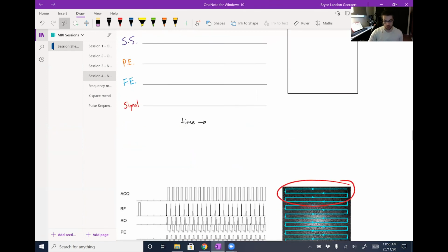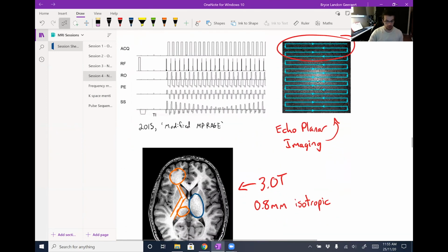I skipped over actually drawing a T1 imaging sequence in favor of showing you a practical one that was used in clinical research. It's a little bit messy, but it gets across those concepts of steady state imaging and inversion time. That's what this RF pulse is at the start. This is the inversion pulse. And you can see at the bottom here, this is TI, which is the inversion time instead of TE. Because we're requiring more than one echo, TE doesn't really make as much sense anymore unless we consider it in terms of acquiring the center of K-space. So sequences like this are usually quantified by TI instead, which is the amount of time that you wait for your NMV to recover after that inversion pulse.